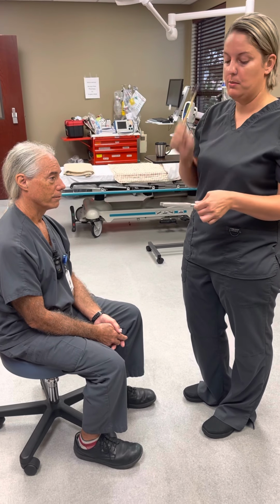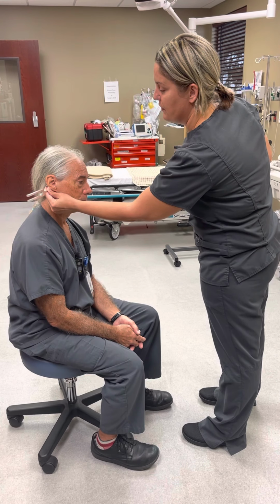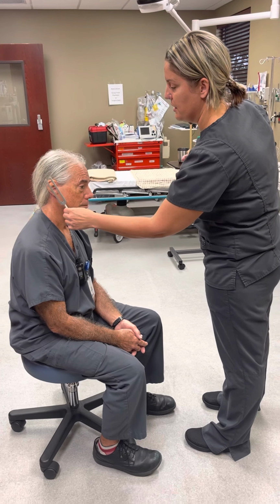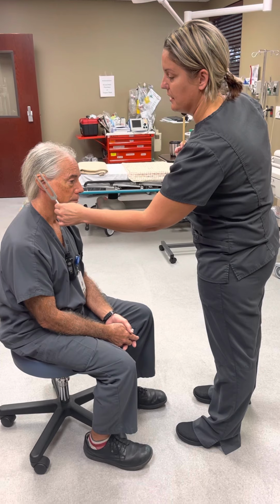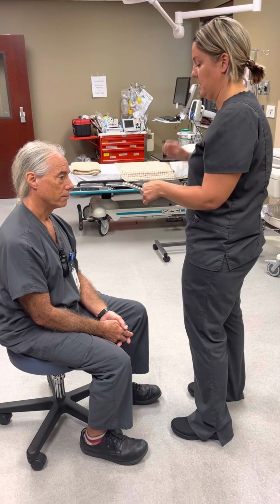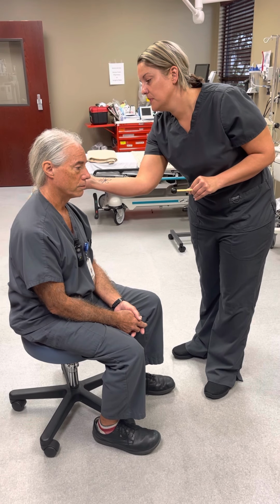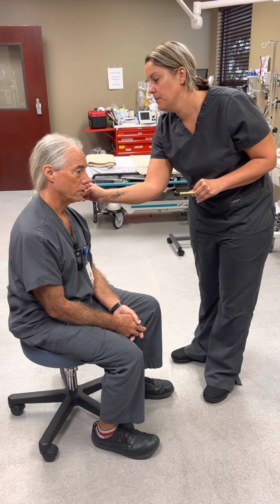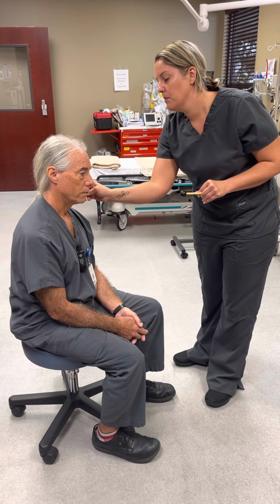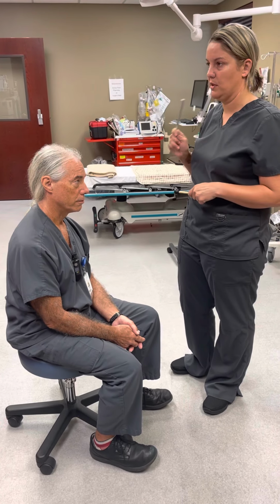So you can hear through the bone behind your ear. Put it on the bone behind your ear. Do you hear it? Yes. Tell me whenever you stop hearing it. Stop. Okay, and then do you hear? Yeah. That's air conduction. Tell me when you stop. Stop. And the air conduction is about double the bone conduction. And we'll do that other side. Hear it? Yes. Tell me when you stop. Stop. Hear it? Yes. Tell me when you stop. Stop. Okay. So that is a tuning fork, and it is a 512, and that's what they usually use for that.